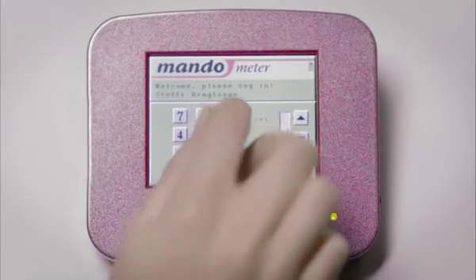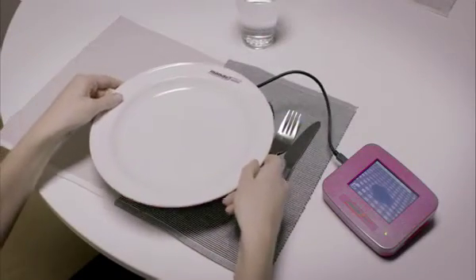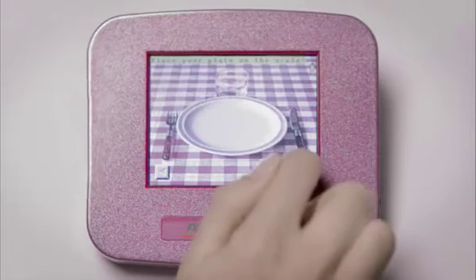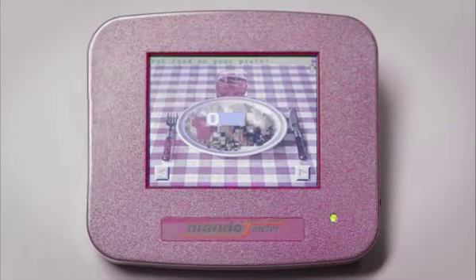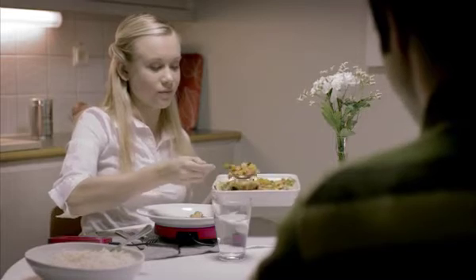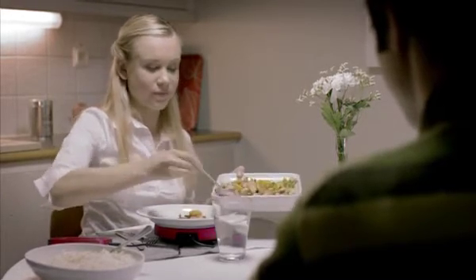Mandometer is a scale connected to a small computer. You put your plate on the scale and then put your food on the plate. Mandometer is programmed to indicate how much you should eat to meet your goal and will guide you through your meal.